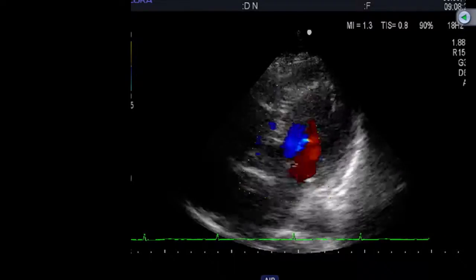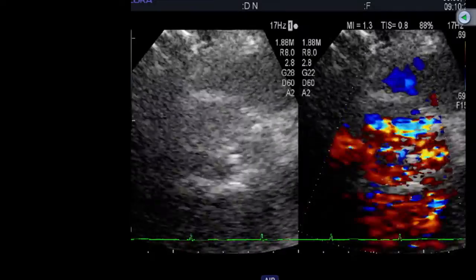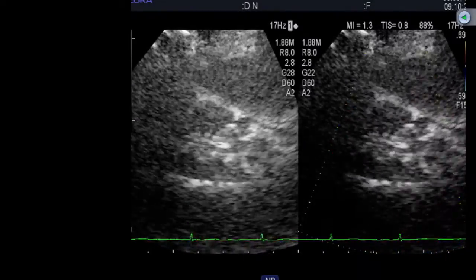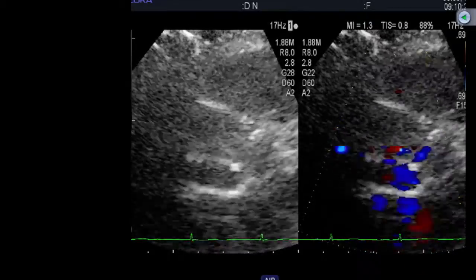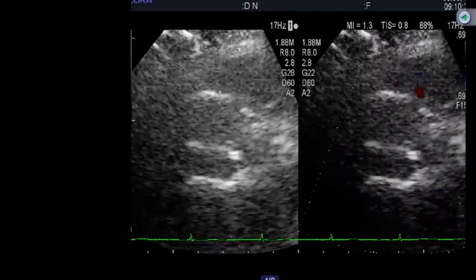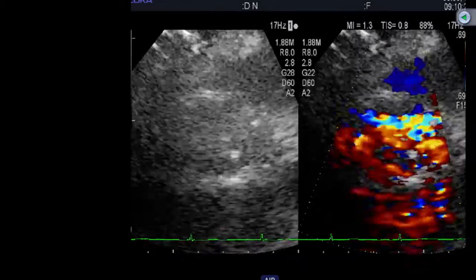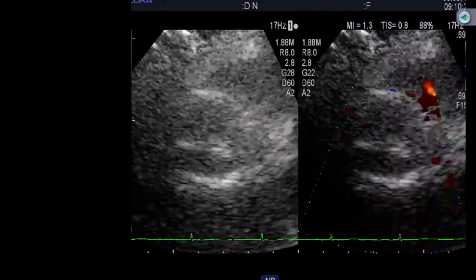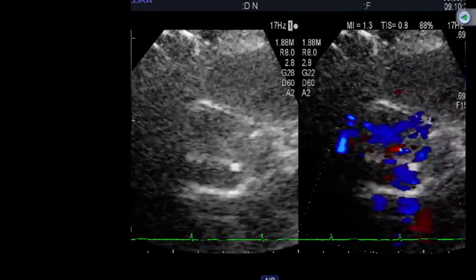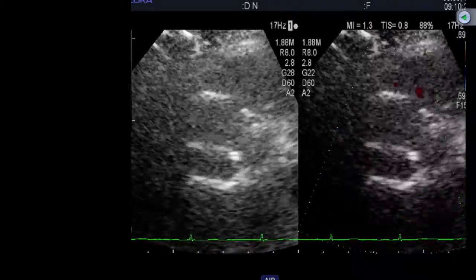The patient has a very tight aortic valve stenosis, and you can see here on the color short axis view, simultaneously, that the aortic valve is extremely tight, tri-leaflet. There is no aortic regurgitation. Severe aortic stenosis, mean gradient is 48 mmHg. Preserved LV function, mild MR, and we are set for the next steps in the intervention. Okay, go back to our slides now.